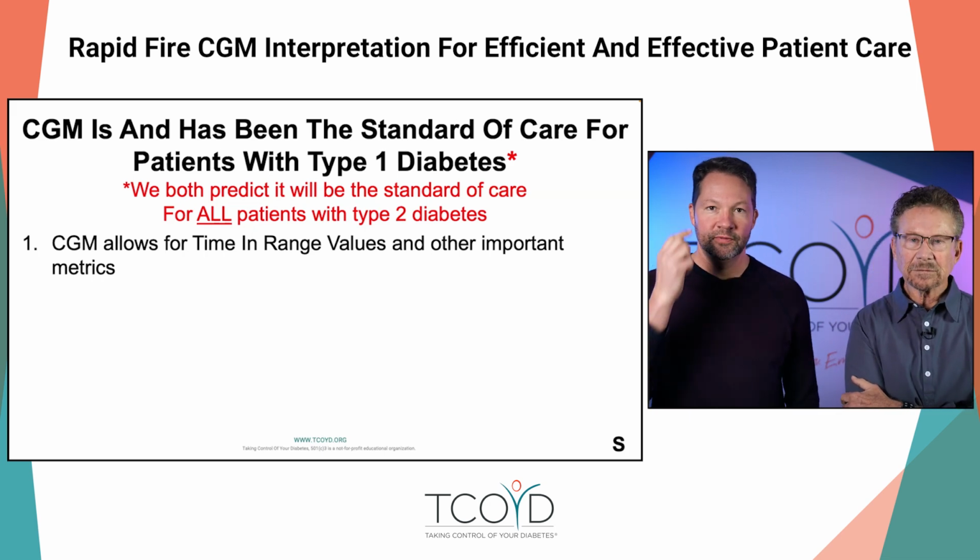Can I just say that it wasn't always that way. When CGM first came out, I first got on mine in 2010, which wasn't that long ago. But then it was really hard to get covered. People thought it was just a fun little tool for people to have. And since then, all the data on improving blood sugars, reducing hypoglycemia, improving quality of life. So we're just using it more and more. And it's kind of like, duh. If you don't know anything about diabetes, you know that knowing your blood sugars is important. So these devices have become a cornerstone of diabetes therapy.